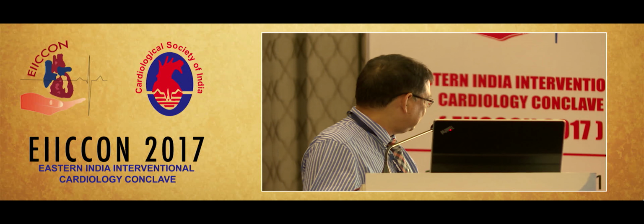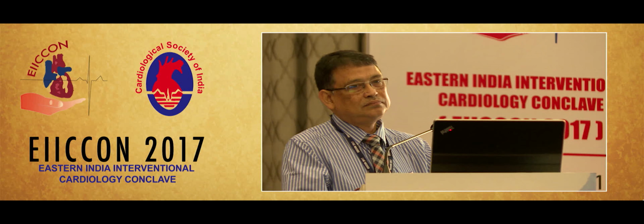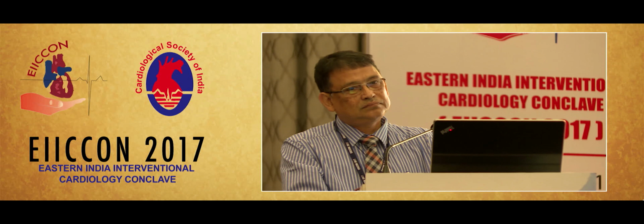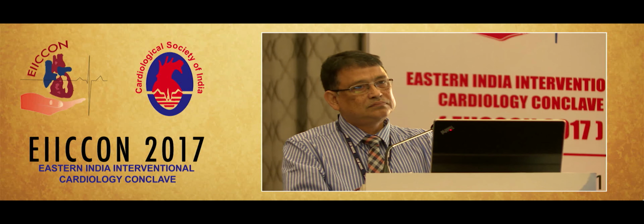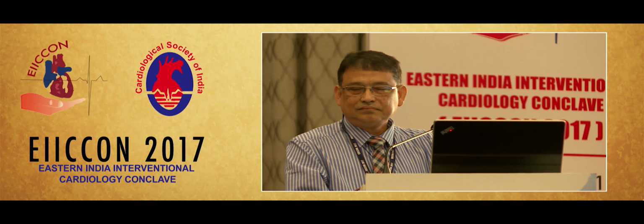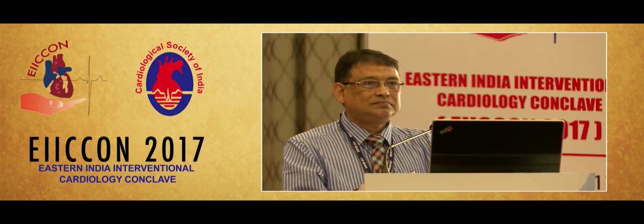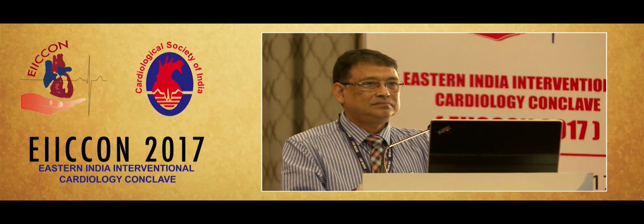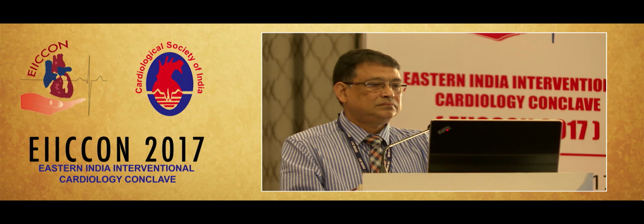Dr. Hiremath, would you have done differently in this particular case? Say, for example, the ostial portion of the LM was also stented in this particular case. Yeah, I think it was done beautifully. I would probably follow all the steps. I think the circumflex here was critically diseased. We have to address the circumflex first, and this strategy allows us to cover the area perfectly well. So I think it was very well done.